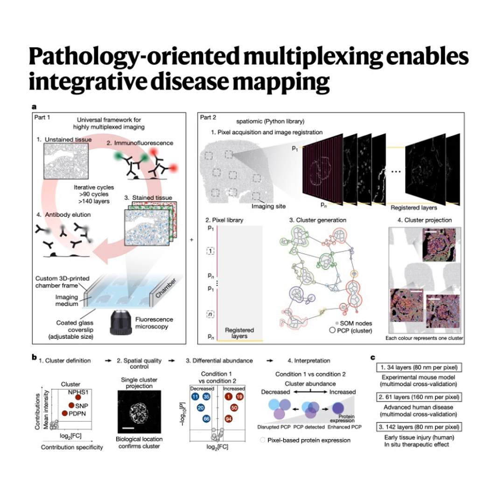You imaged the same spot 95 times. How do you ensure pixel number 5 million from cycle 1 perfectly lines up with pixel 5 million from cycle 95, especially at 80 nanometer resolution? Another clever solution. Standard practice often uses nuclear stains like DAPI, but those can fade or wash out, needing restaining, which adds variability and cost. PathoPlex uses something different. N-hydroxysuccinimide ester, or NHSE.